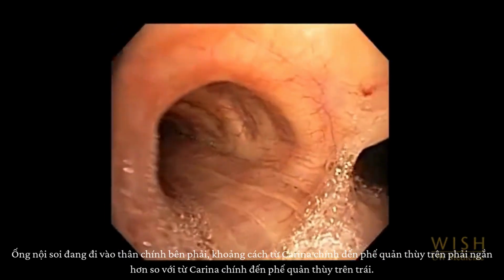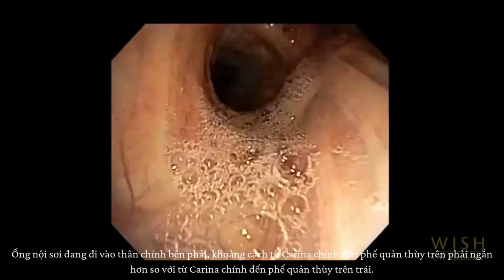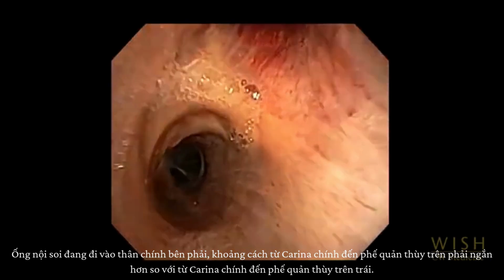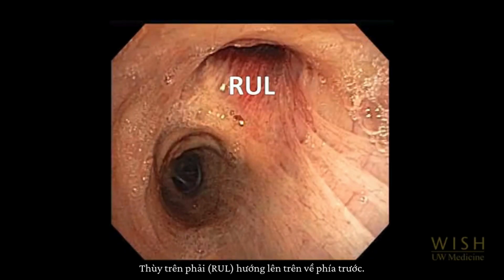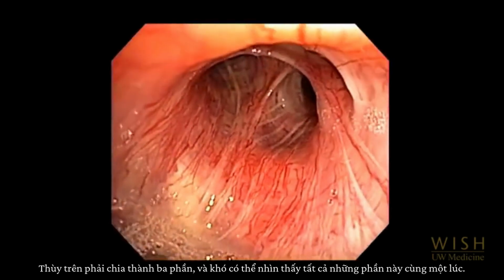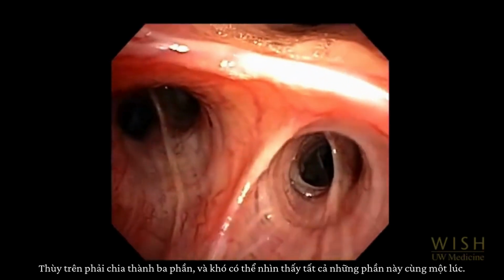The bronchoscope is entering the right mainstem. The distance from the main carina to the right upper lobe bronchus is shorter than from the main carina to the left upper lobe bronchus. The right upper lobe bronchus takes off anterolaterally. The right upper lobe trifurcates into 3 segments. It can be hard to see all of these at the same time.